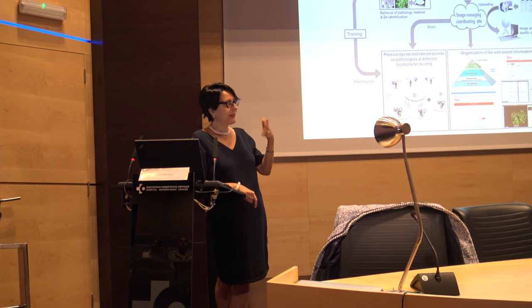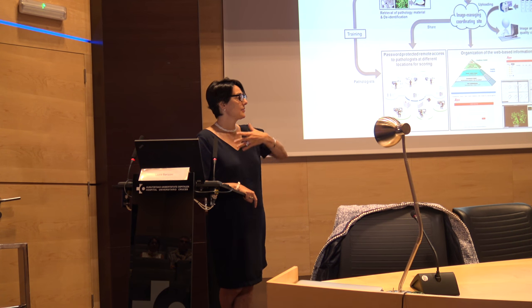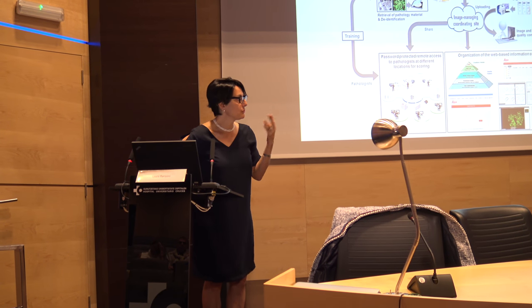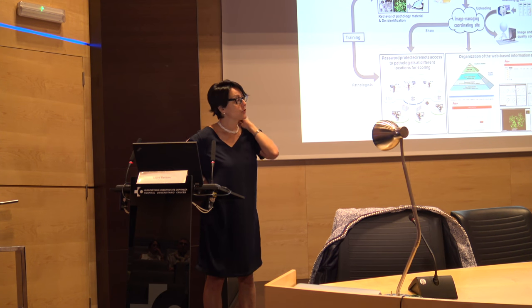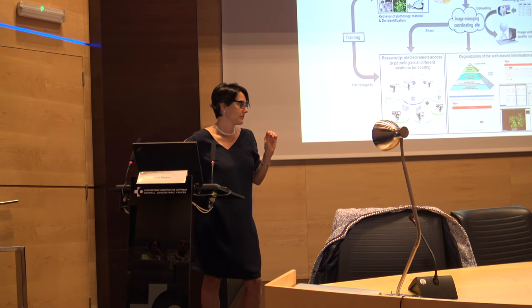But the machine is different now. To do the studies you need not only one center, you have to use multiple centers. So the machine has to learn to read through the different sections. And we are creating algorithms to adjust, but at the same time, you can adjust only that much.